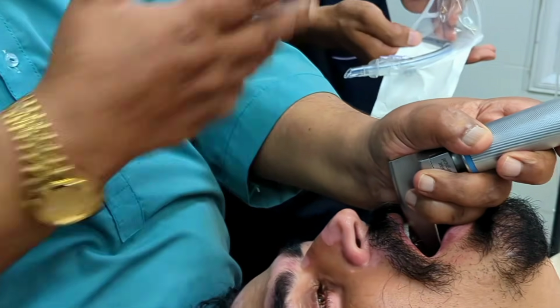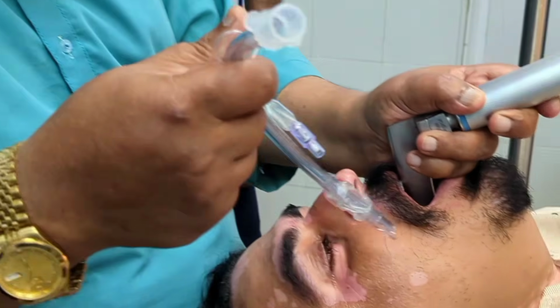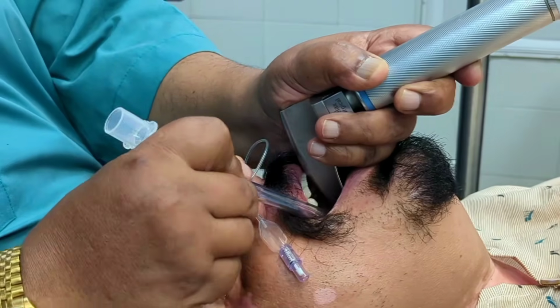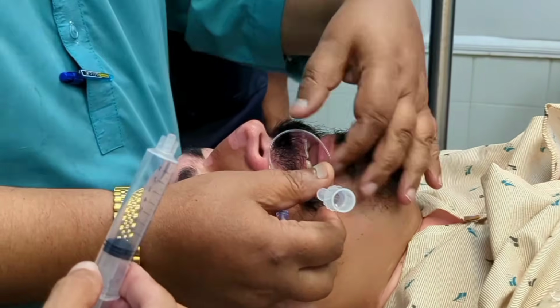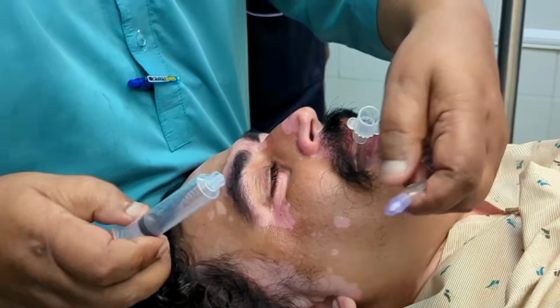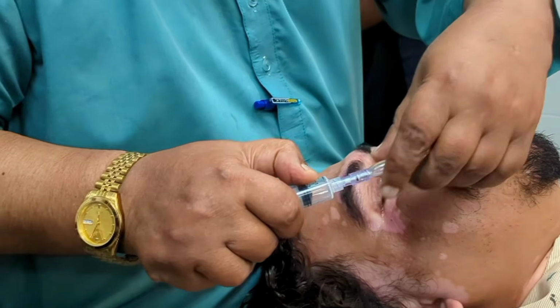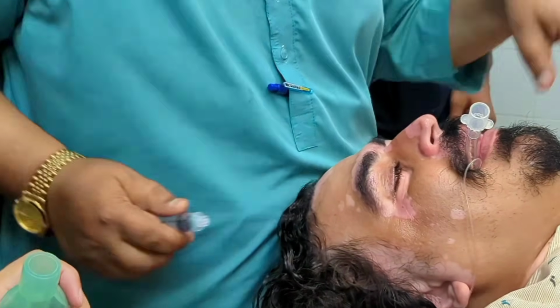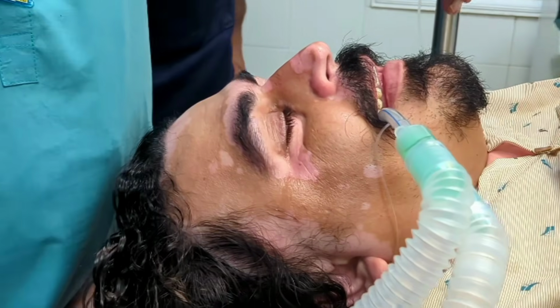With gentle technique, the laryngoscope was inserted into the mouth and advanced carefully to lift the tongue and epiglottis. With the vocal cords clearly in view, an endotracheal tube, ETT, was prepared and advanced carefully through the vocal cords into the trachea. Care was taken to avoid trauma to the airway. Once the tube was in place, the laryngoscope was removed and the tube was connected to the breathing circuit.